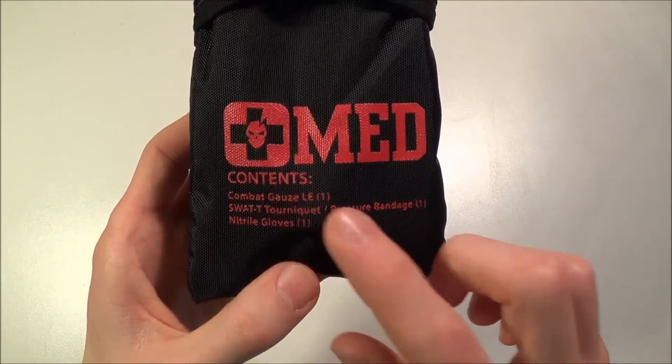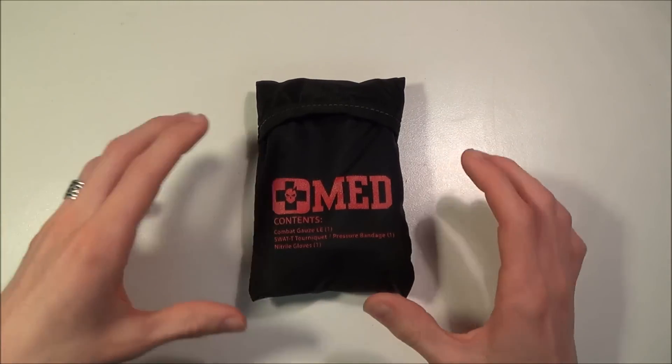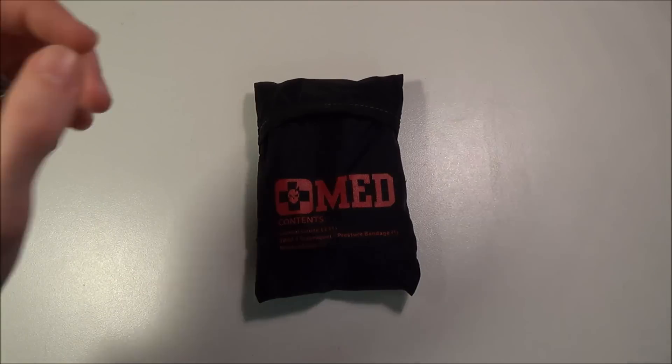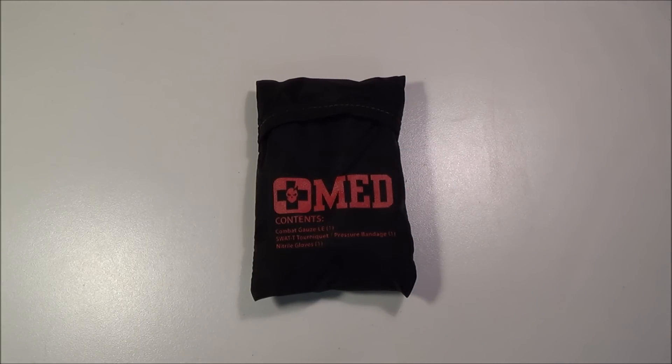The SWAT-T tourniquet is a soft tourniquet — it looks like a piece of inner tube material. It's a stretchy, soft tourniquet that you basically just stretch and wrap around the limb. It doesn't have the crank like the CAT tourniquets — the combat application tourniquet. I know a lot of people who actually prefer this over the ones with the crank handle because these are more compact. I've heard reports of these breaking less and being more durable, and some people say the crank isn't really necessary — the SWAT-T works just as well. I have no personal experience with it, but some medical professionals I've talked to say they swear by them.